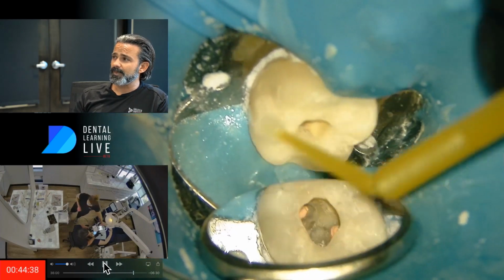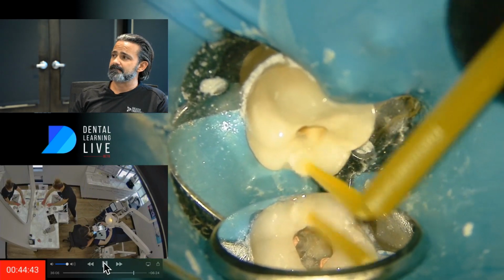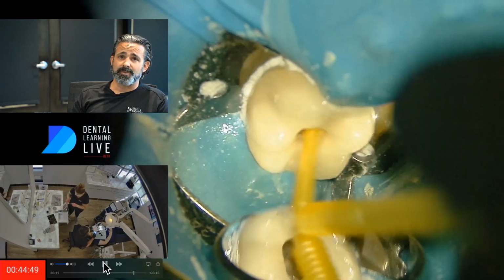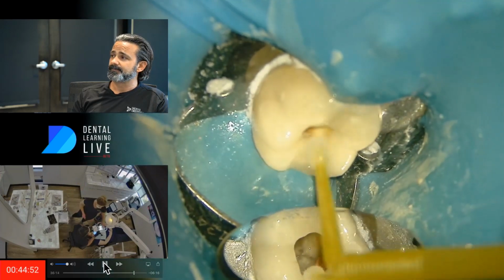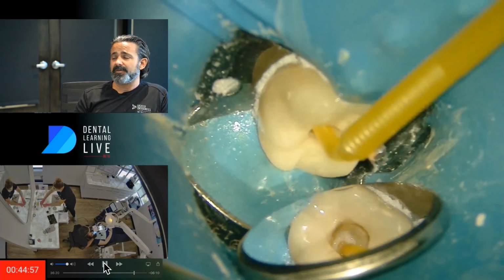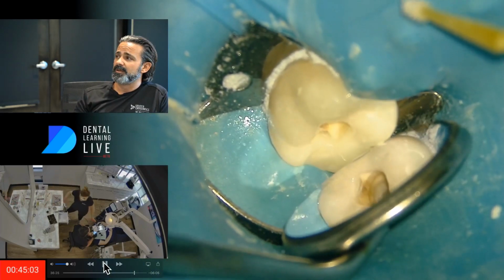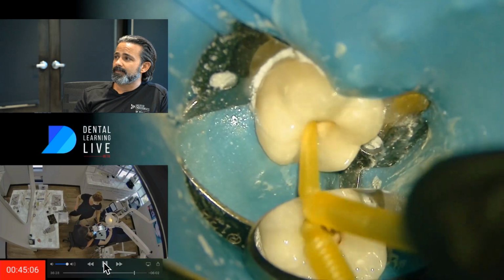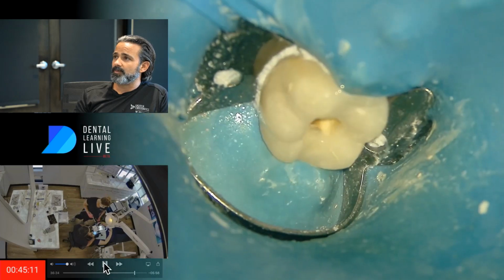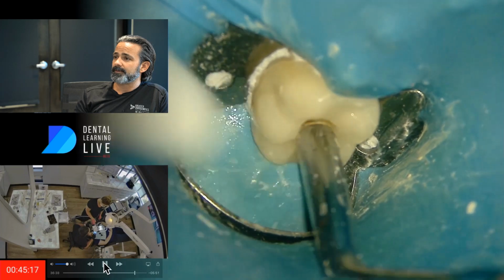So now I'm going to just clean up. I clean up the occlusal table. I'm just using alcohol right now and a bendy brush. We're 44 minutes into this. Sometimes my assistant will give me a few of them until I feel like I get things clean with the alcohol. And then look around here, and then we'll blow this dry. All right.